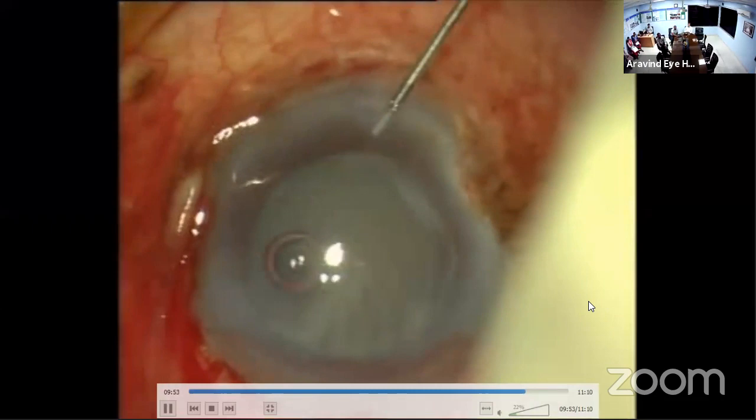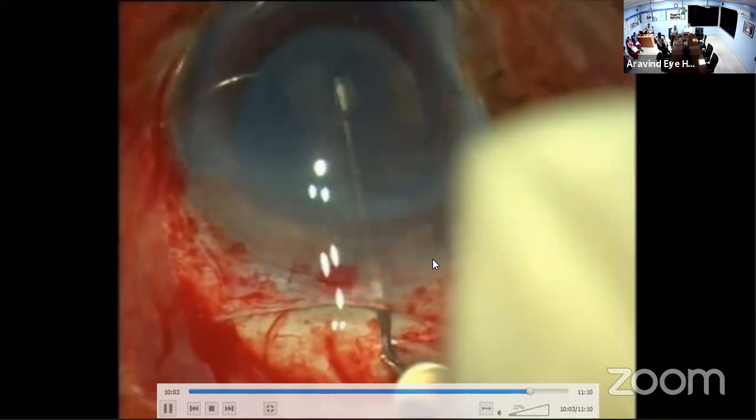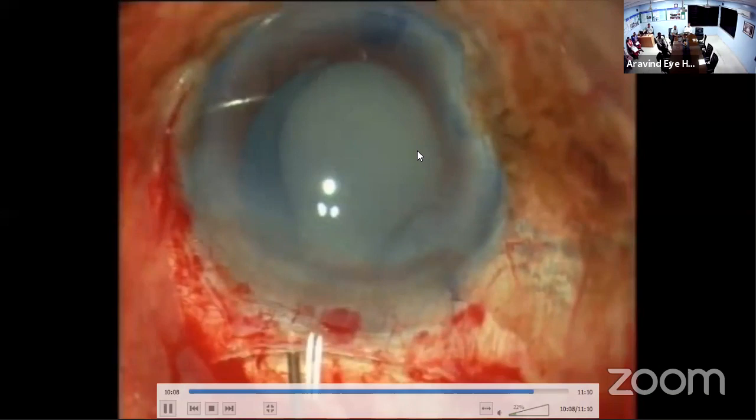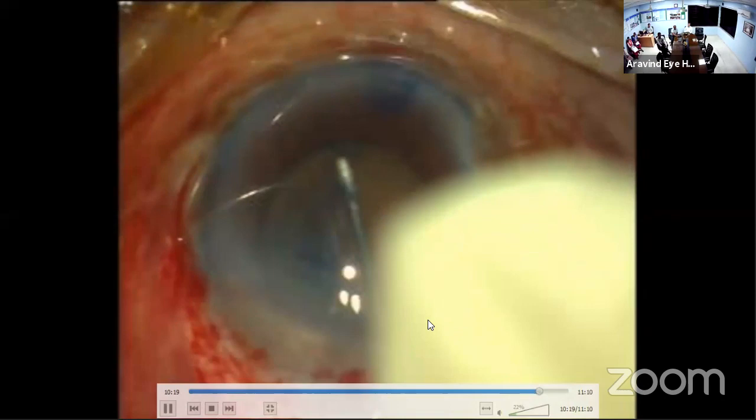When you take him up for surgery, create the tunnel, make a paracentesis, and drain all the cortical fluid that is there in the anterior chamber. The most important step is to stain the capsule properly. In these cases, the bag complex is generally going to be weak. If the bag is too weak, you can do your rhexis with the forceps. In this case, it was not that weak, so I could do it with the cystitome.